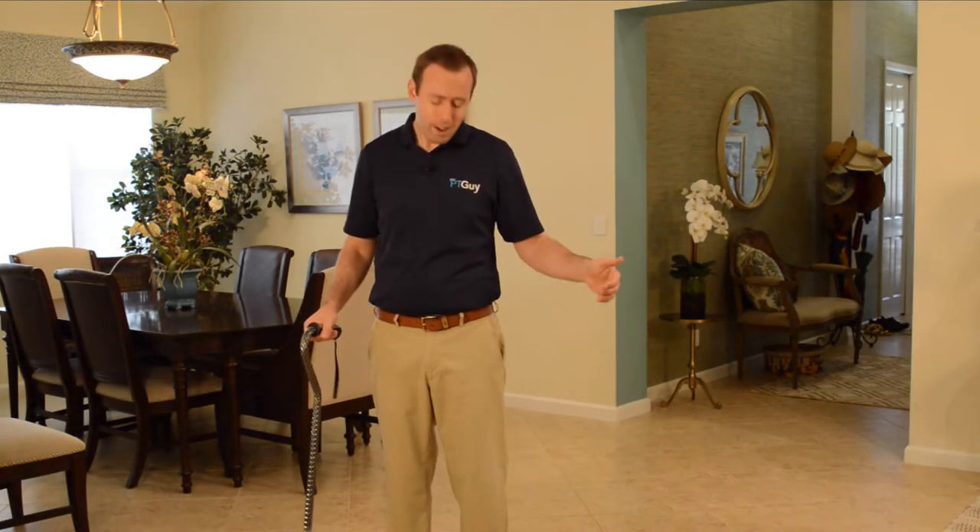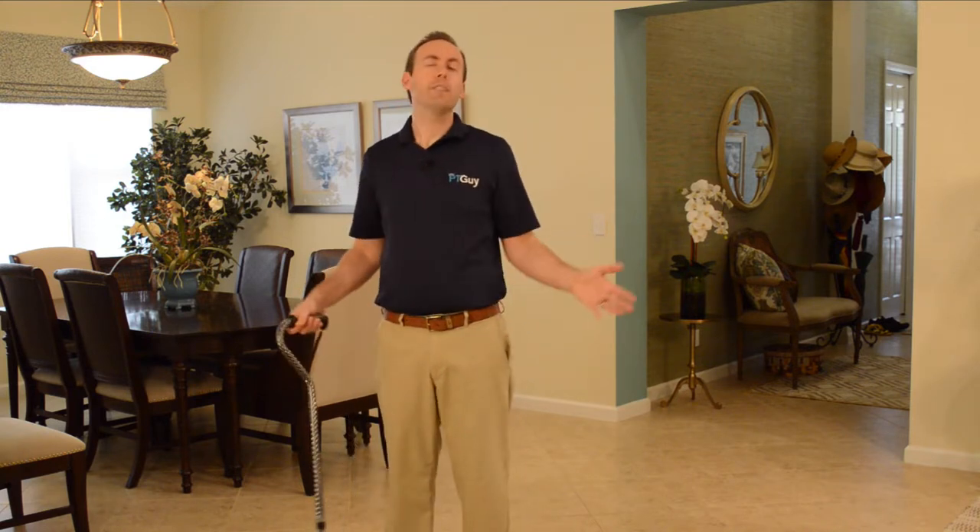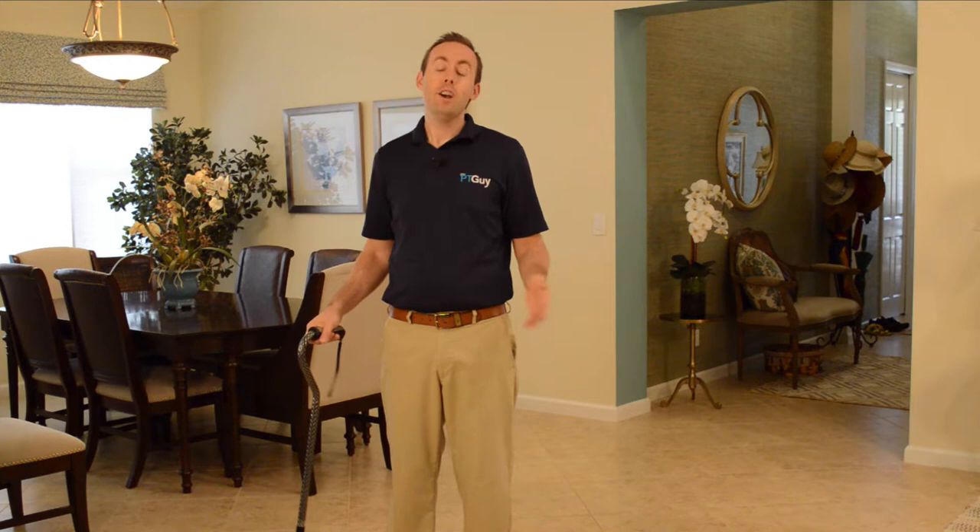Your leg hurts — maybe you have knee arthritis, hip arthritis, or big toe gout. Whatever the case, it hurts and you want to walk and get your life back. I'm Sean, your PT guy. I help people move better and stay independent so they can enjoy their lives. In this video, I'm going to teach you how to walk with a cane and reduce that pain in your leg.